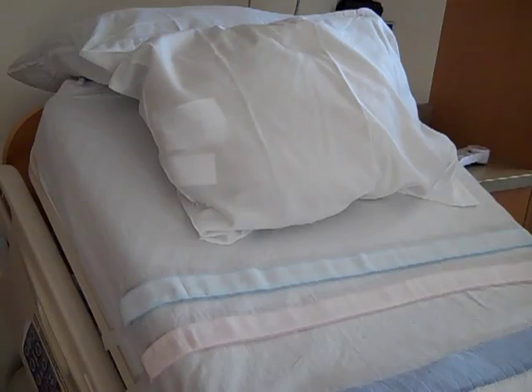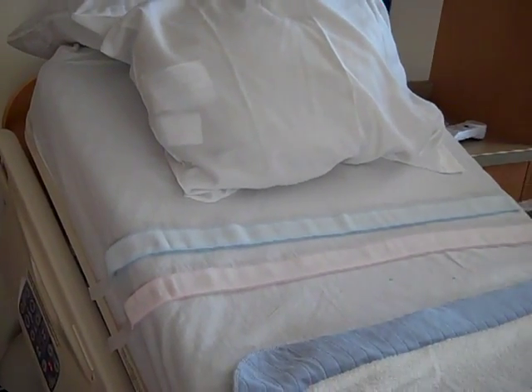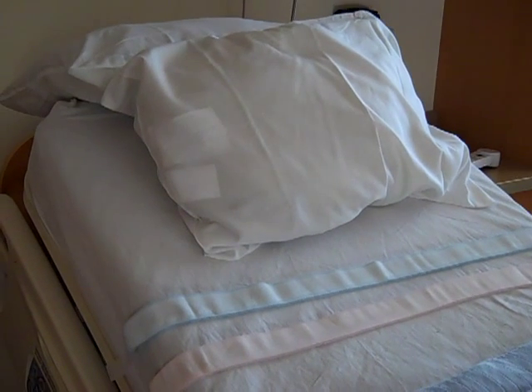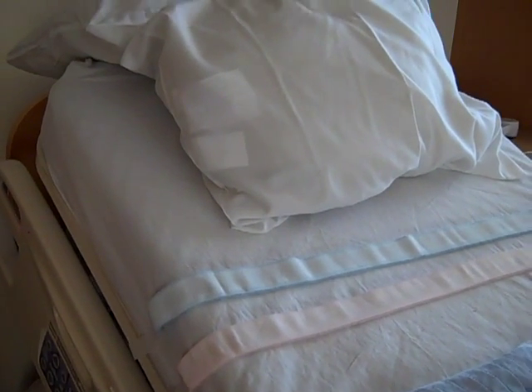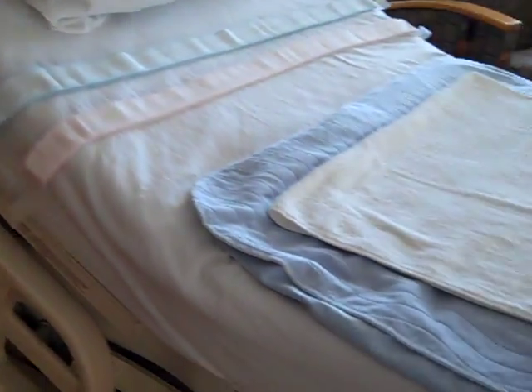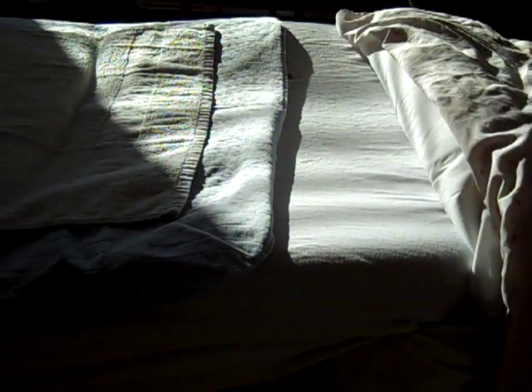The bed that's used in labor and delivery is specific to the purposes of having a patient who is in labor and the time for her delivery, as well as remaining in the bed, usually for a period of time for recovery. The bed is easily utilized. The end of the bed drops off. That helps make it accessible for the patient to deliver.